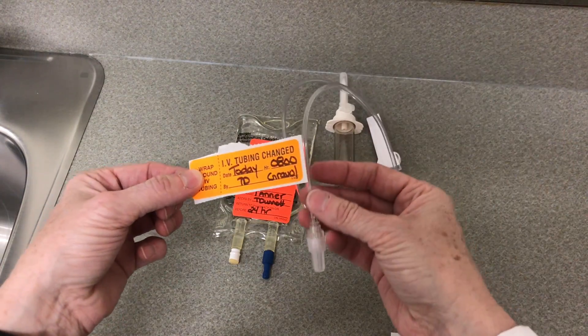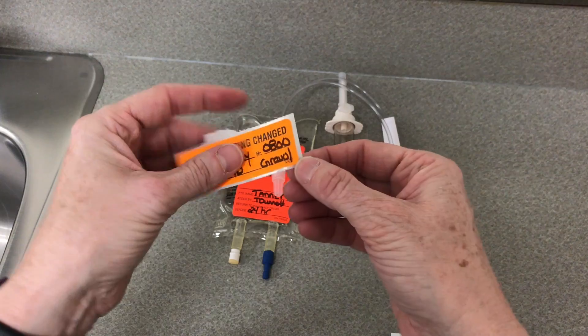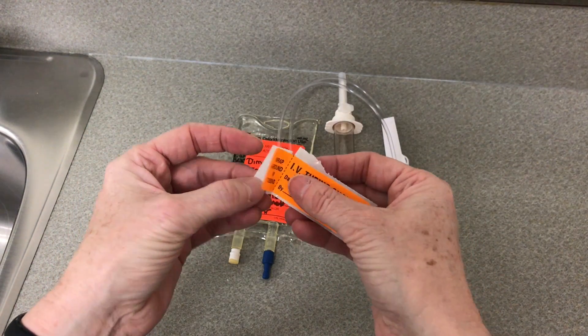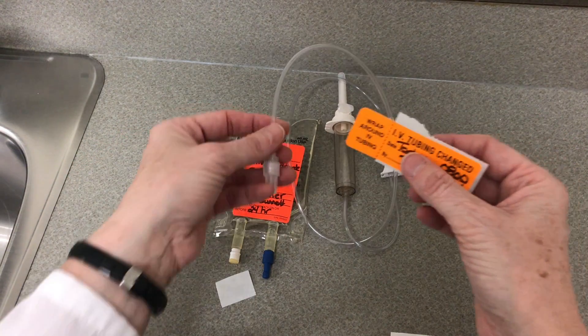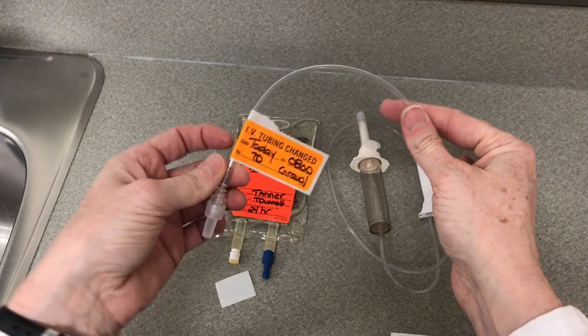I'm going to attach that onto this line here. Now with these labels you do not need to take off all of the plastic — in fact leave most of it on. Just take off the little piece of plastic at the end here and that will allow you to wrap it around and secure it so it's readable.